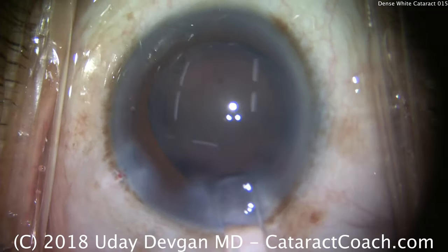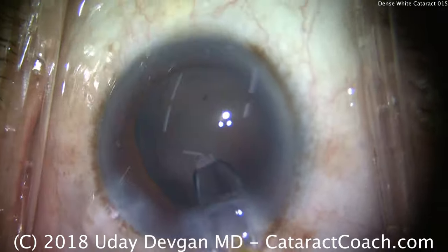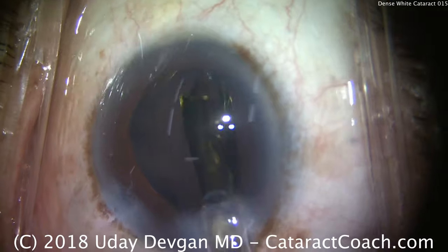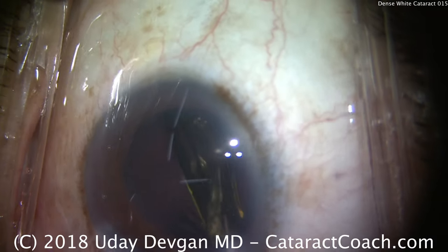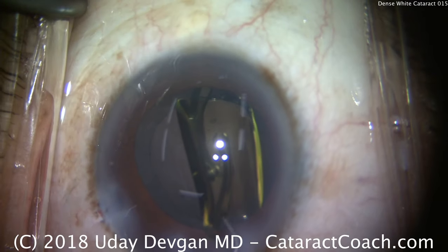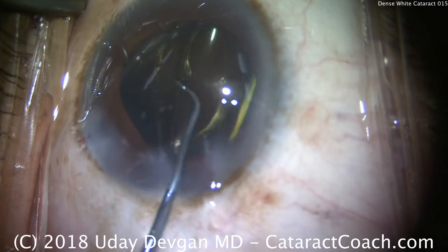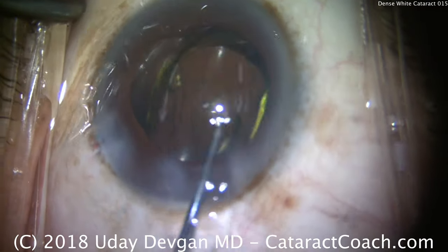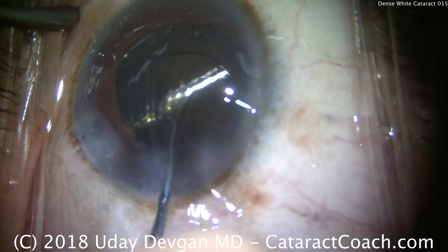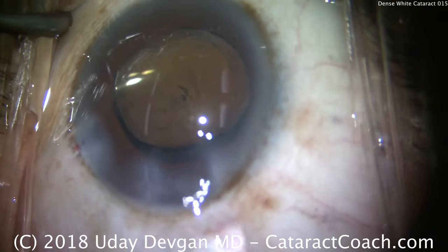Here comes our lens — a single-piece acrylic lens. We're going to put this right in the capsule bag and we'll deliver that lens. And we'll unfold it carefully, making sure that the entire lens — both haptics as well as the optic — go completely within the capsule bag. Again, the patient's moving around a bit; she's just so surprised to be able to see light. This patient had bilateral white cataracts and really hadn't seen much in a couple of years. So there's the lens in pretty good position — I'm happy with that.